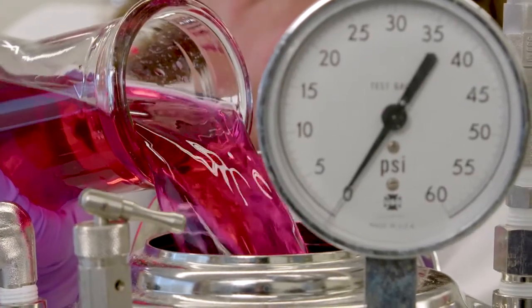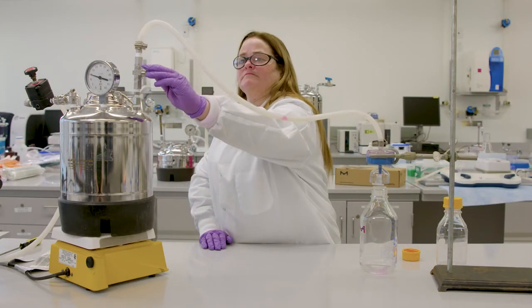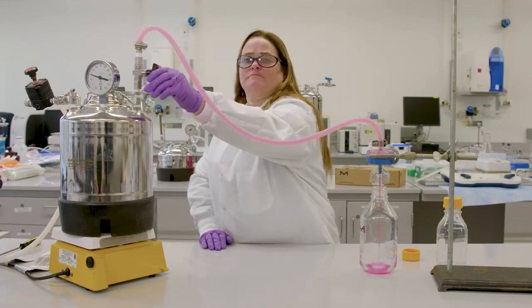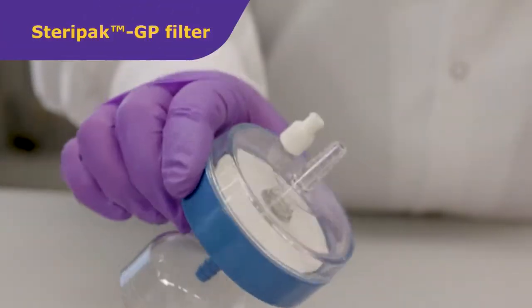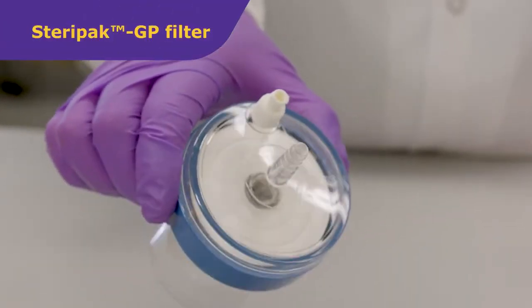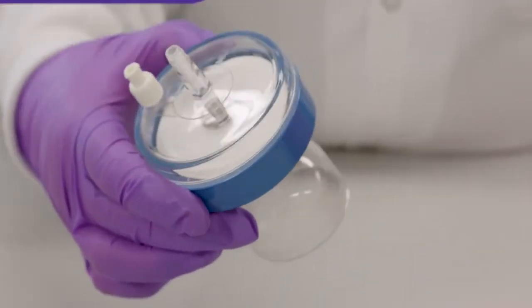Today, we will show you the steps on how to filter sterilize large volumes, 10 to 20 liters, of simulated tissue culture media with a pressure-driven filter unit called the Steripak GP filter. Devices containing 100 square centimeters and 200 square centimeters of filtration membrane.